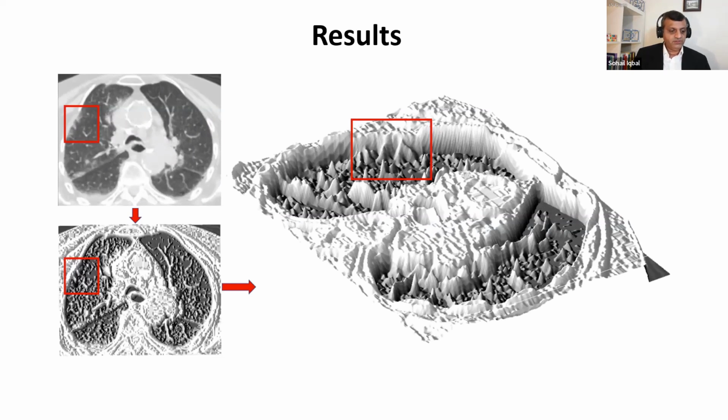So here is one image in which the low star filter, if I just consider the PD of the low star filtration, could not detect that this is a COVID image. The reason is that you can see not so many saddle points over here, just peaks, and this is the COVID region. Over here it's very close to the wall.